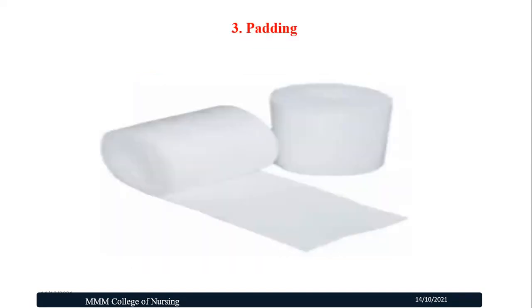The third thing is padding. An adequate padding with the cotton is necessary to protect the skin and bony prominences under the plaster cast. Padding is applied directly over the skin or over a covering of stockinette. This padding can be applied and it becomes very smooth and does not produce any wrinkles. So it makes it easier for the application of the POP.